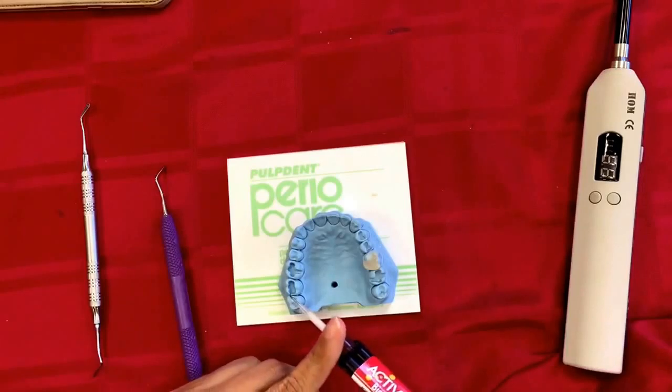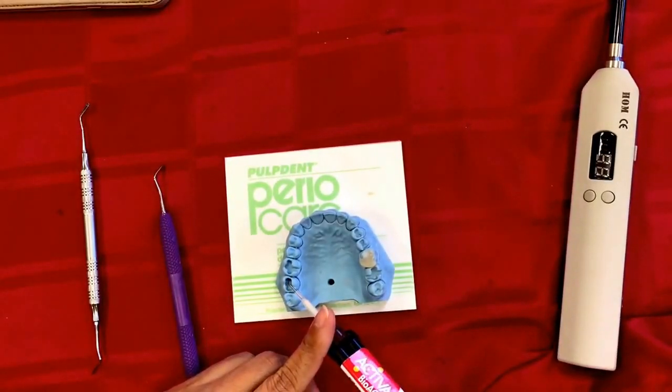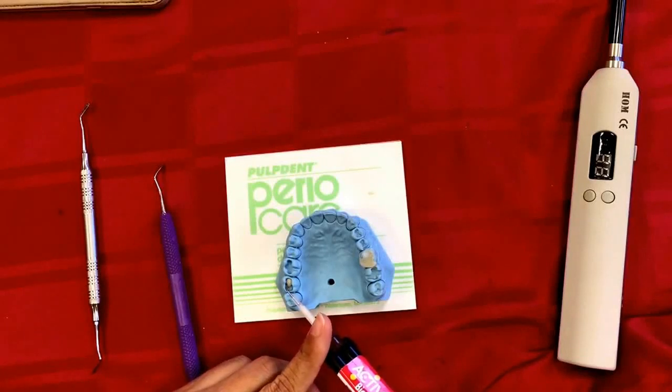Keep the tip at the base of your prep and start squeezing, following the pattern of the floor of the prep. Take the tip with you and keep pressing the trigger — the material comes out very easily. The key tip is: please don't let the tip come out of the restorative material at any point.